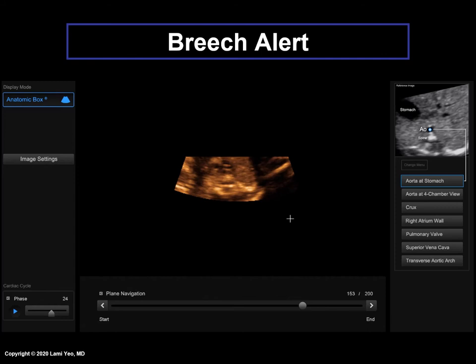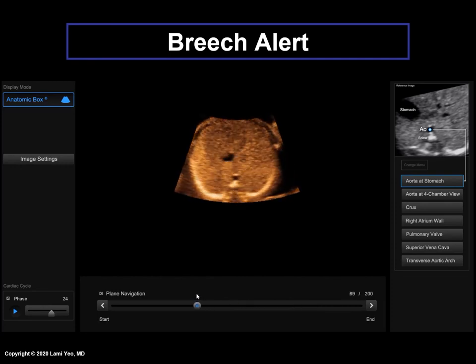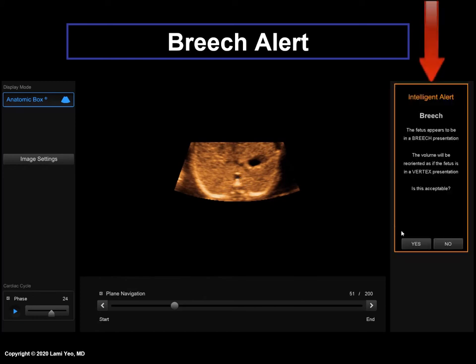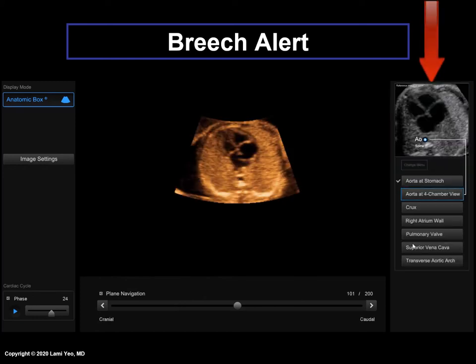Here is an example. One has to scroll to the other end of the STIC volume to locate the stomach because the fetus is breech. Once the aorta is marked, a breech alert will appear. After clicking yes, FINE automatically converts the breech to a vertex presentation, and the marking process will continue with the next structure to be marked — the aorta at the level of the four-chamber view.